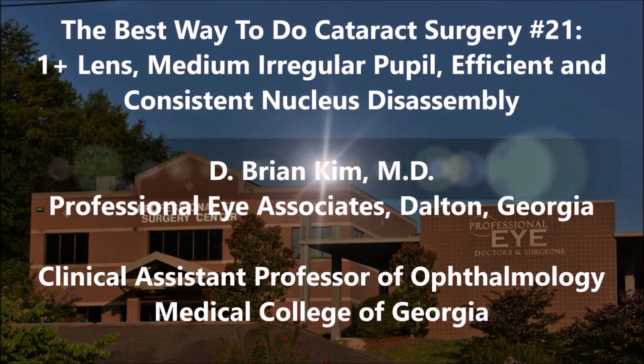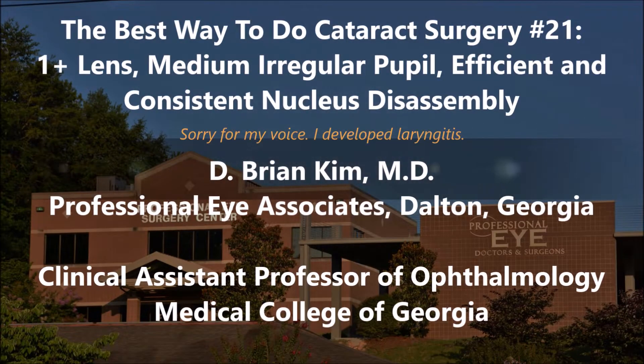Hi, this is Brian Kim. I'm going to share with you case number 21 in the best way to do cataract surgery series. This is a 1 plus dense lens, a medium and irregular pupil.